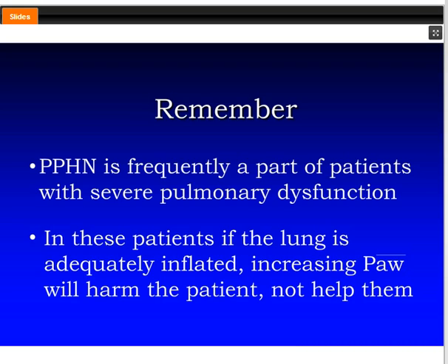All right. Now, with regard to patients with air leak or air leak syndromes, besides ventilator changes, how important is it to position the infant? You know, prone, supine, bad lung down, that type of thing. Well, I think it is helpful, particularly with PIE. If the baby has more severe PIE on one side than the other, that should be the side that goes down. The same with a significant air leak.